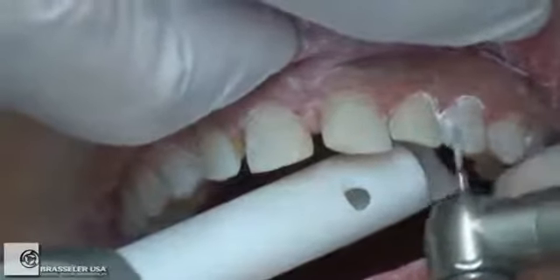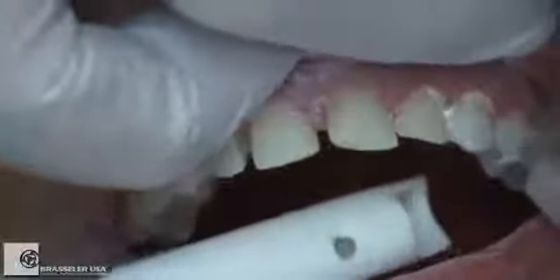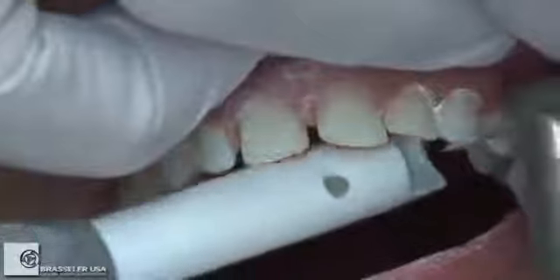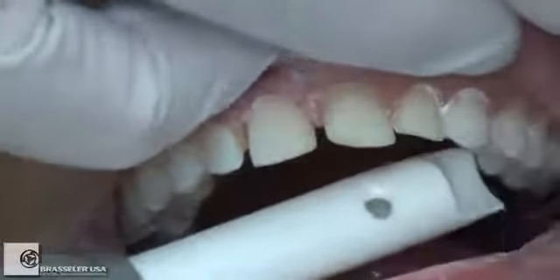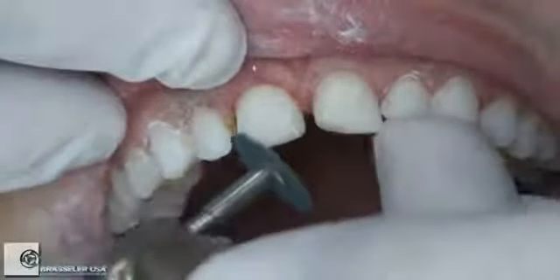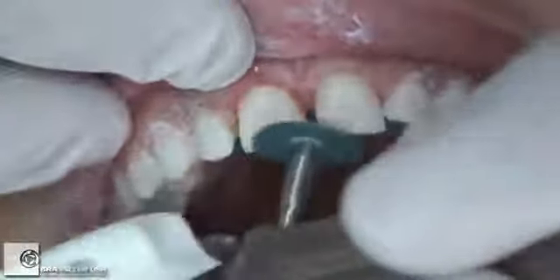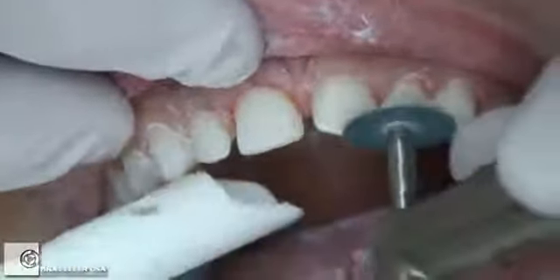You saw from the bonded functional aesthetic prototype that we have at least 6 to 7/10 probably facially, and we've got that really without preparing teeth at all. Go up to the incisal edge and put just a slight finish line on the lingual. Now we're really almost done at this point. Now we're going to smooth or tie in surfaces, the incisal to the proximal and the incisal to the facial.